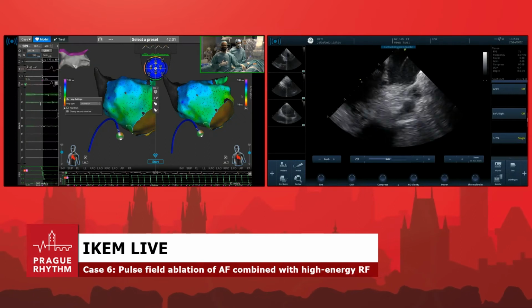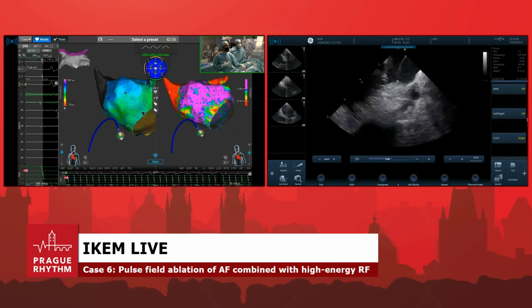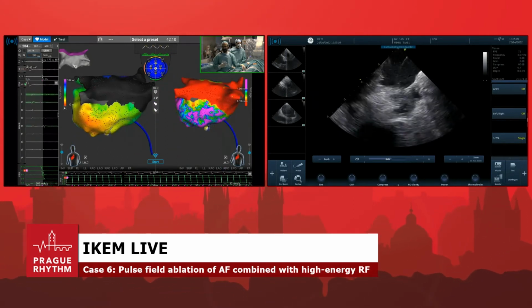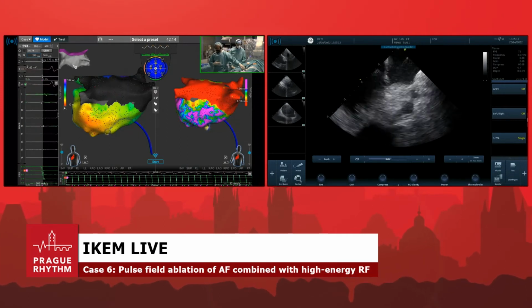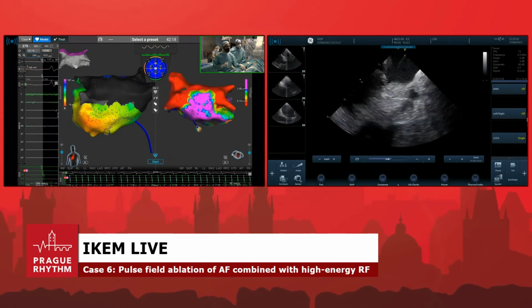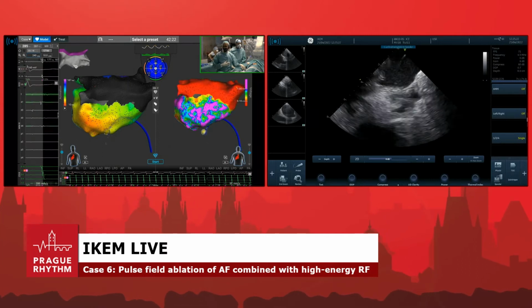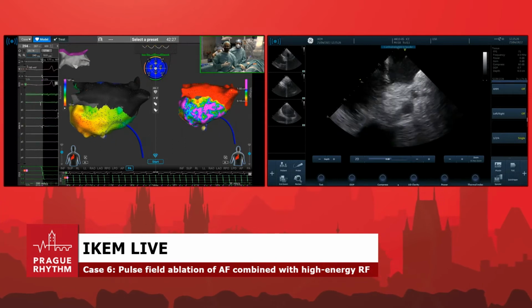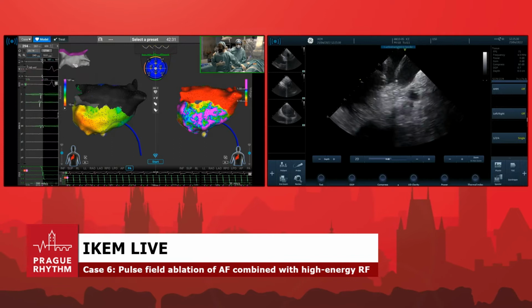But as you remember, during ablation of the right pulmonary veins, we had a transient ST elevation, and this transiency lasted for like 4 minutes. And then the patient became stable again. We gave some pressure support for like 2 minutes, and it all came back normal. We don't really have an explanation why it happened. We have to think about it more, but I can tell you that's the first time that we ever saw something like this.